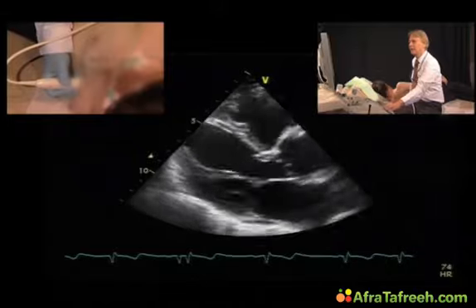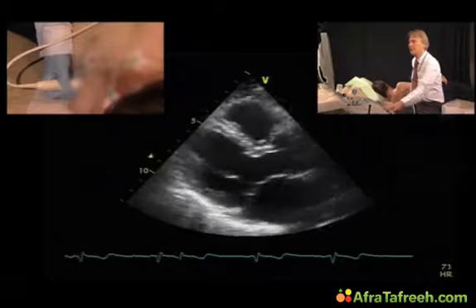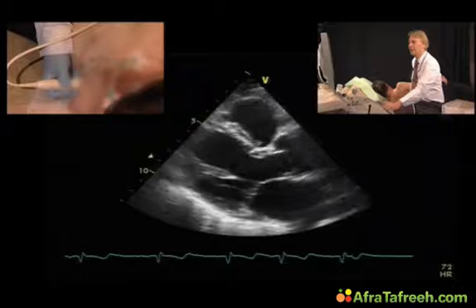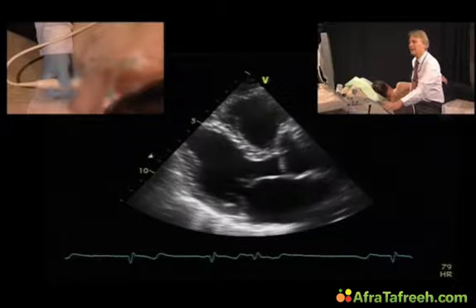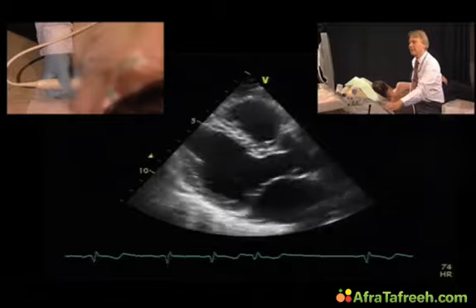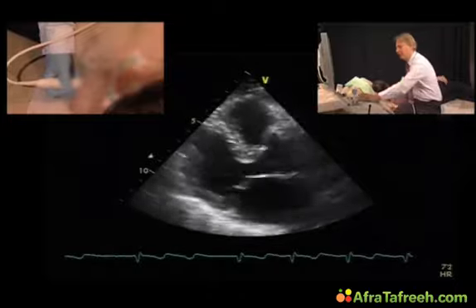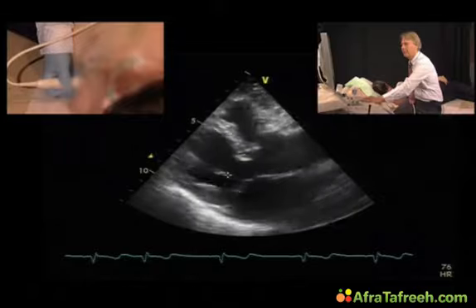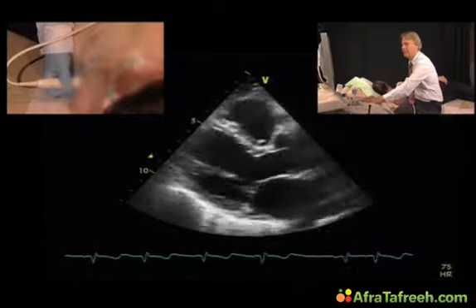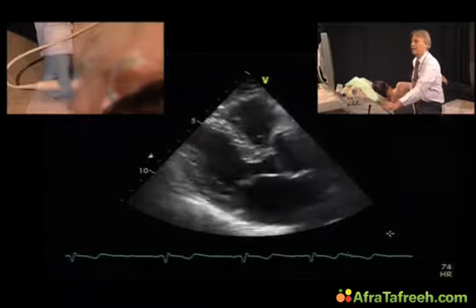And if we look at the texture of the mitral valve, we can see that it has a softer appearance, not very echogenic as you would find it in sclerosis or calcification, even though there are certain areas on the valve which do show degenerative changes. Here on the papillary muscle, and here in the posterior ring of the mitral valve as well.